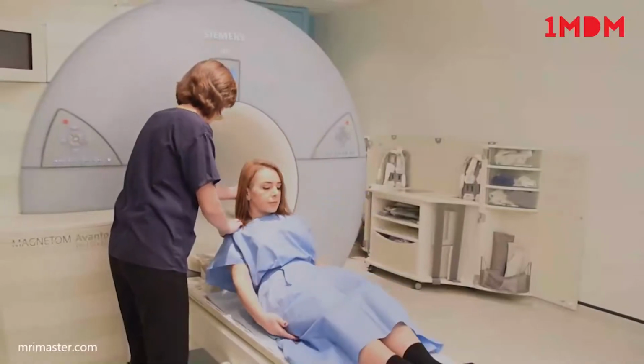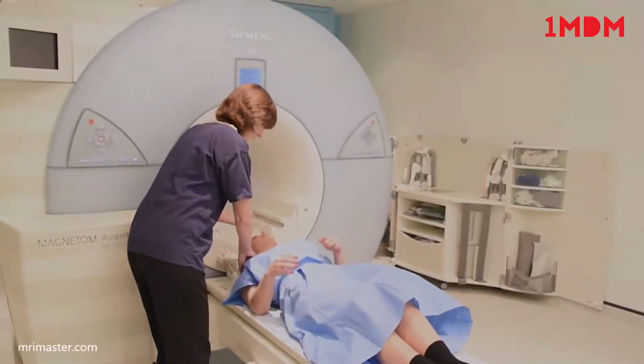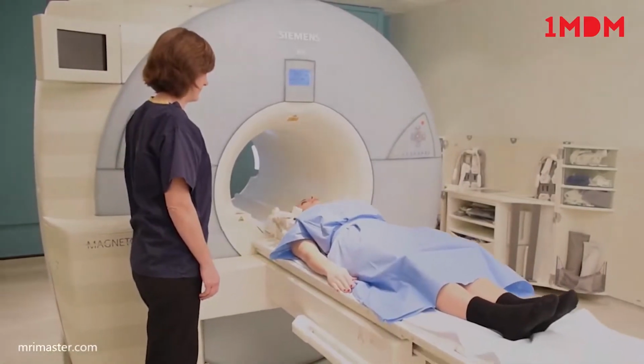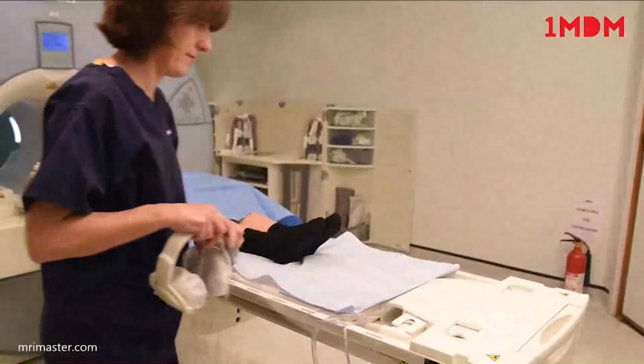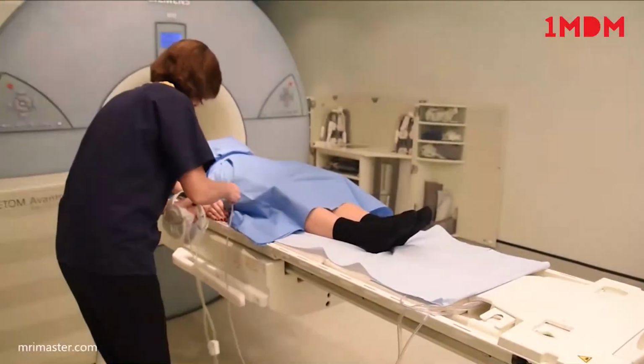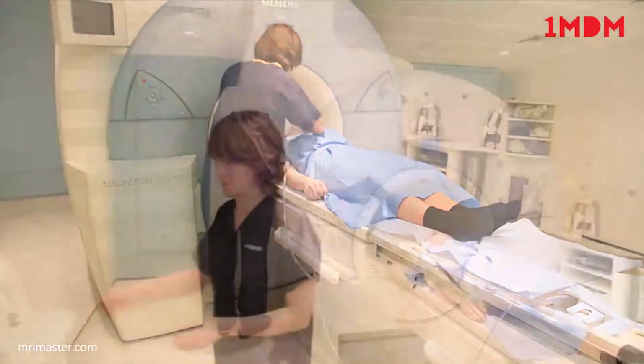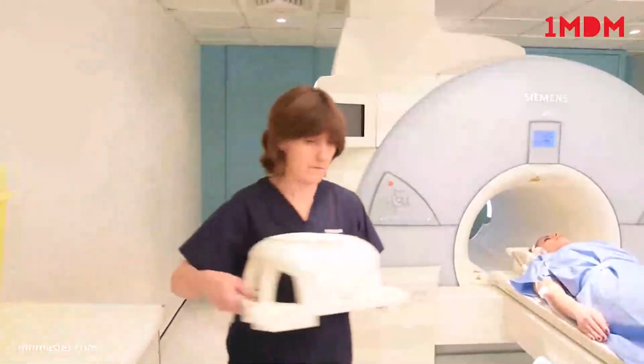Once the patient has been screened and is deemed safe to have an MRI scan, ask them to lie supine on the scanner table with their head in the head coil. Give the patient an emergency alarm, making sure they know how and when to use it. Give the patient ear protection in accordance with the manufacturer's guidelines.